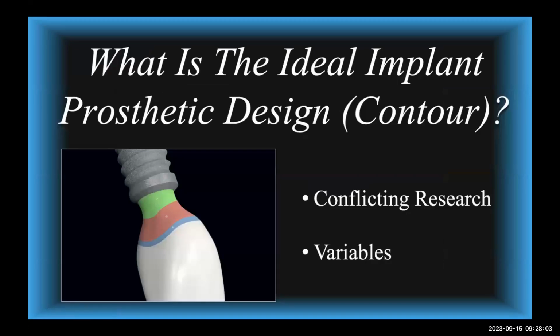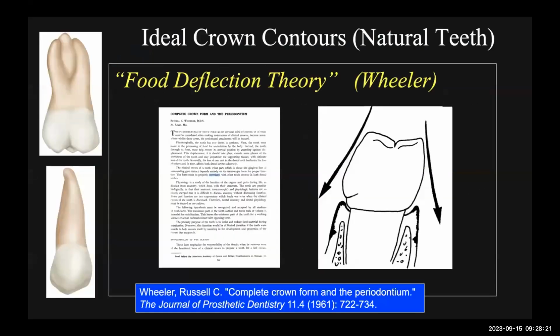So if I have an implant, how do I design the best contour? What is the ideal prosthetic design? Well, if you look at the literature, there's conflicting research. There are a lot of variables that come into play, so I'm going to give you a summary.